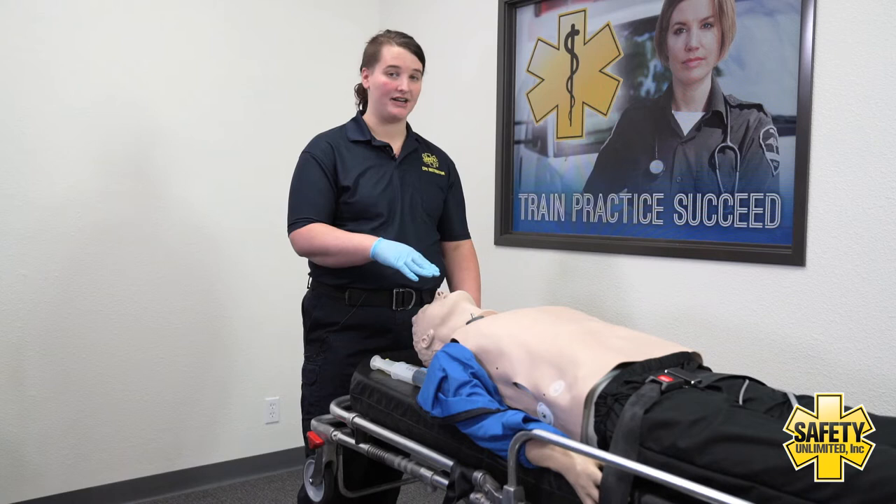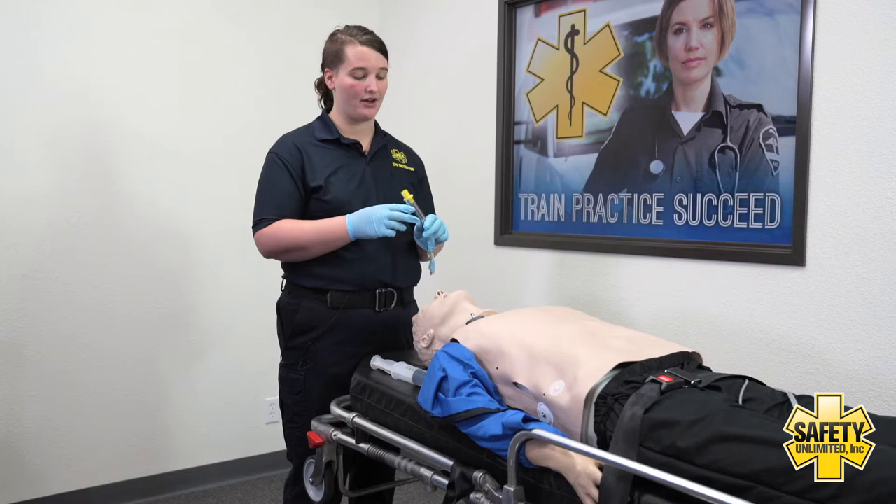This is a video demonstration on the insertion of a King Airway. This patient would be ventilated as I prepare my equipment. I'm going to make sure to choose the correct size King Airway for my patient.